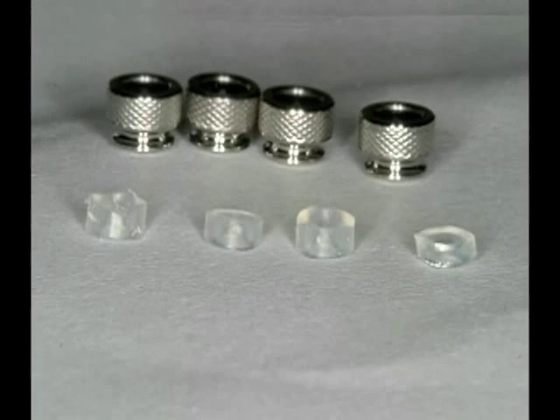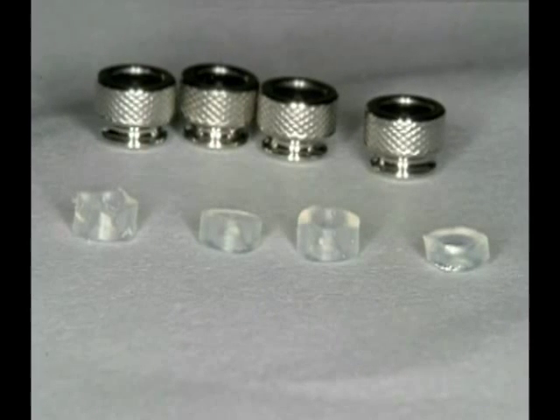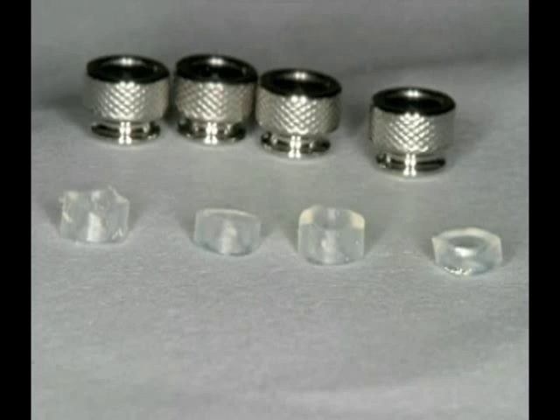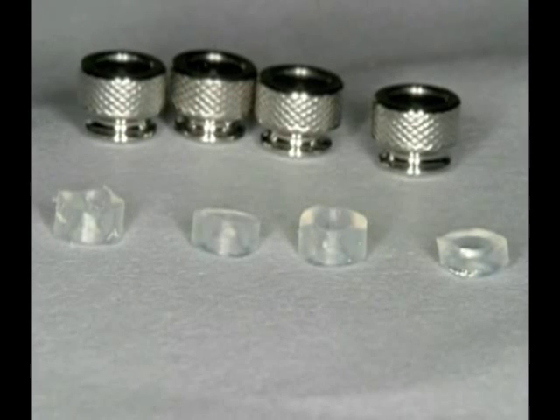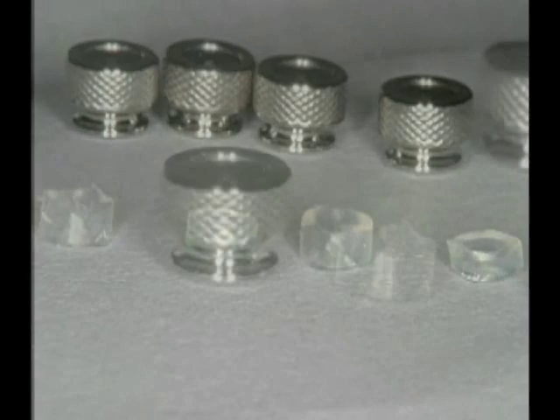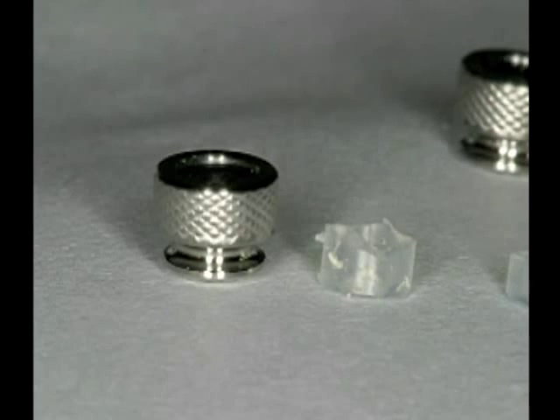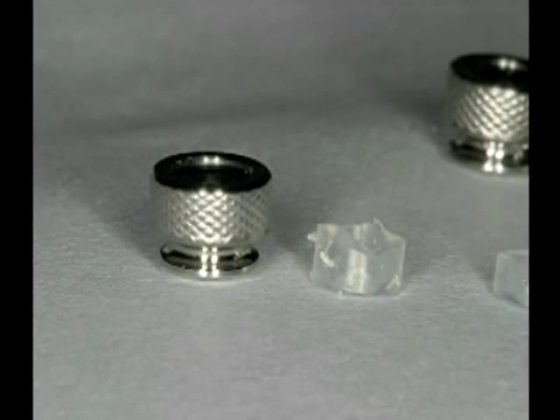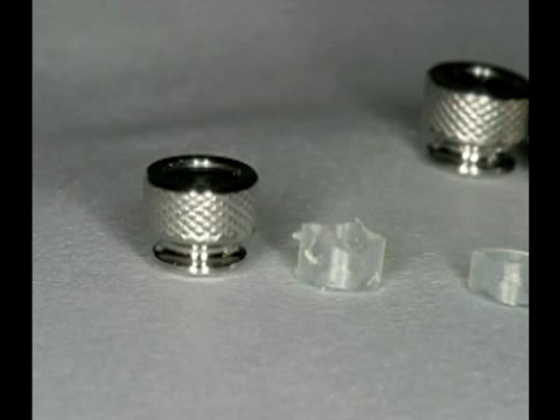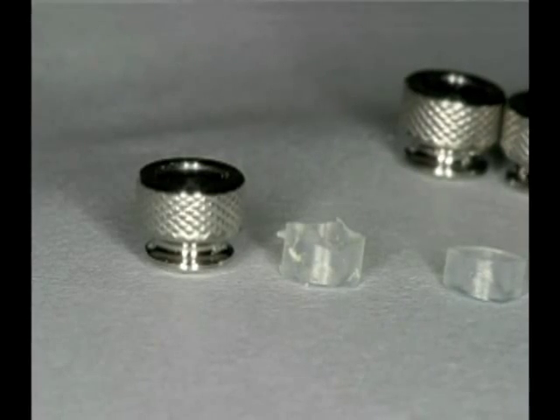Also, in this case, we're going to use the micro housings. These are the MH2 housings from Imtech Corporation. These have a medium retention, stronger than the MH1s, but also allow for just a little bit less angulation difference. If it comes to pass that we need to modify our housings and go with an MH1, which allows for a little bit more implant divergence, we can do that. You'll also notice that there are shims here — plastic or elastic blockout shims that are placed over the square portion of the implants after they are in place. That will help to block out any parallel walls or undercuts so that the acrylic doesn't flow and get caught under there, which ends up locking in the denture.